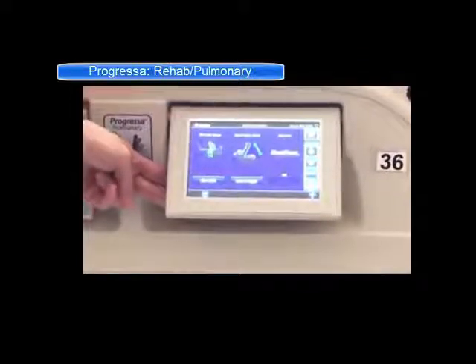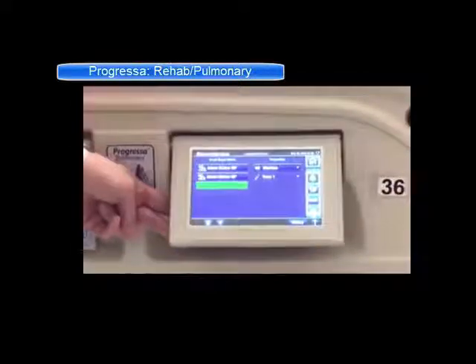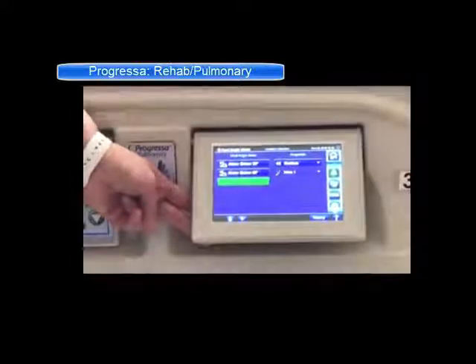You also have a head angle alarm with this bed, so if someone needs to stay above 30 or 45 degrees, you can set that and it will alert if anyone comes in and lowers their head.